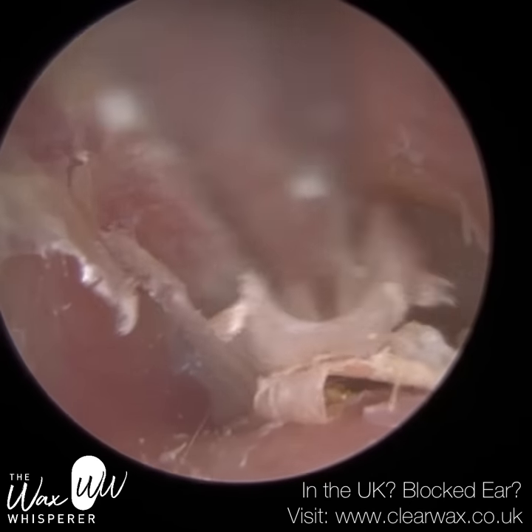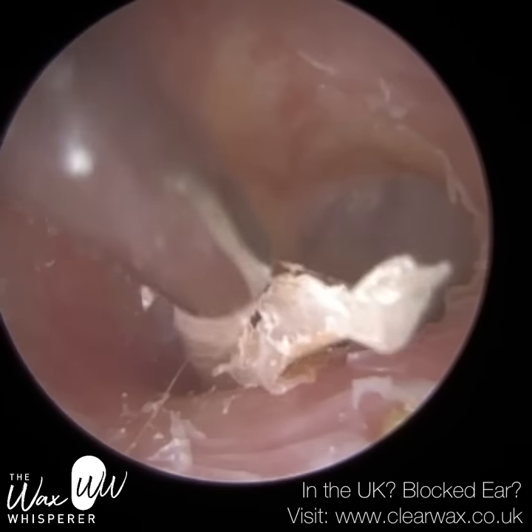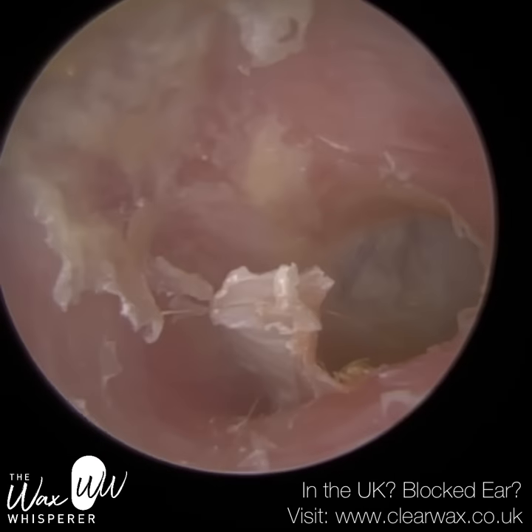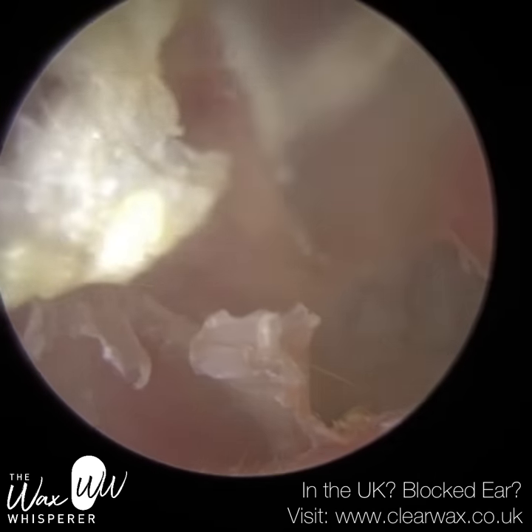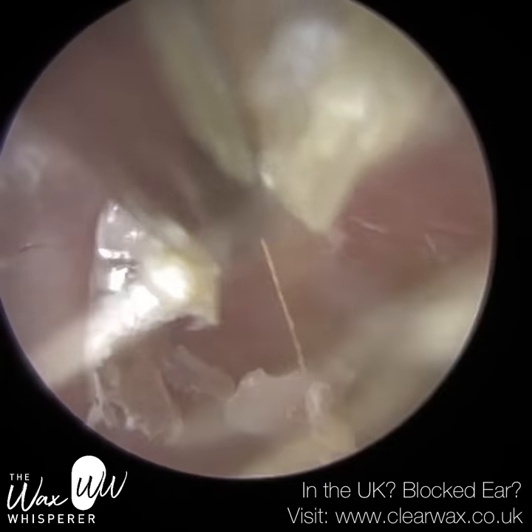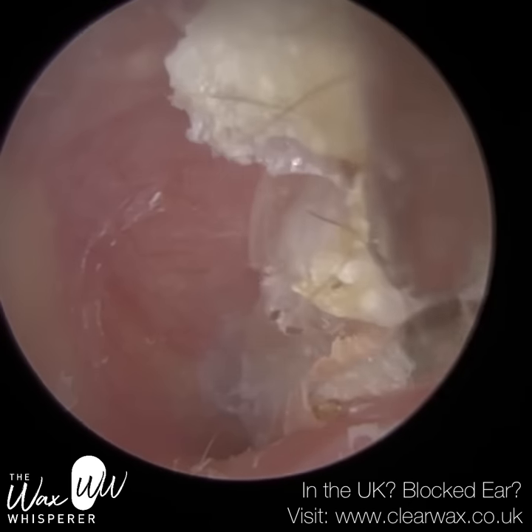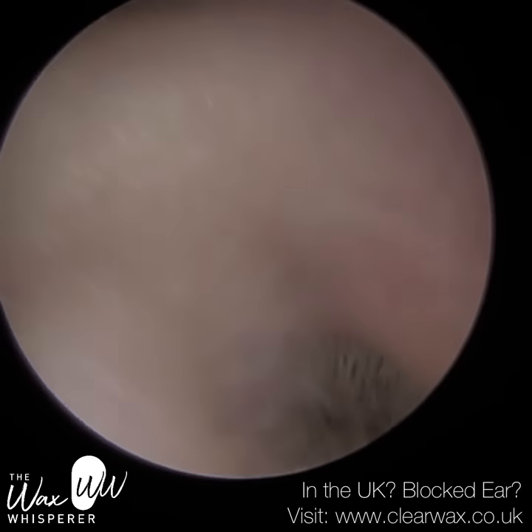There is one part of the ear — just at the bottom of the screen there — there's a piece of hardened keratin that's embedded within the canal wall, and underneath that keratin we may have some exposed bone, and that will need to be removed. I did try to remove it today, but it was rock solid. Every time I made contact with it, it was so hard that the instrument would glide off it.